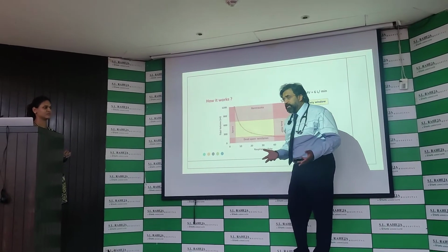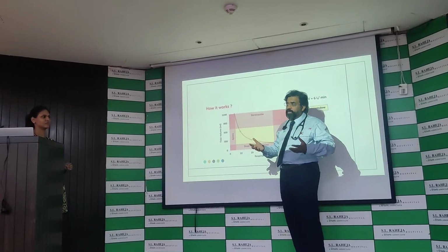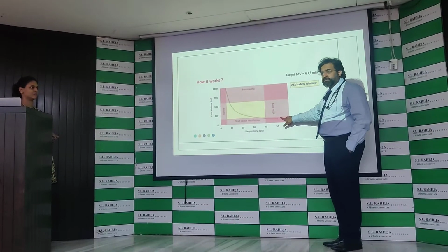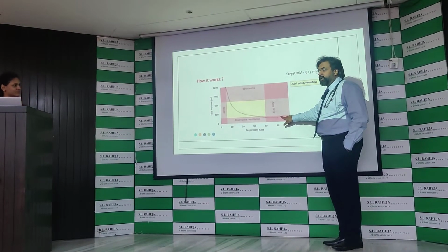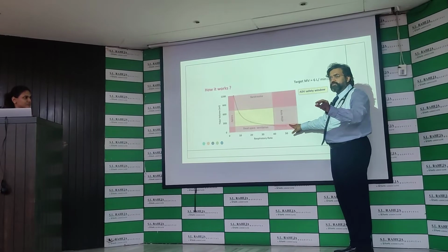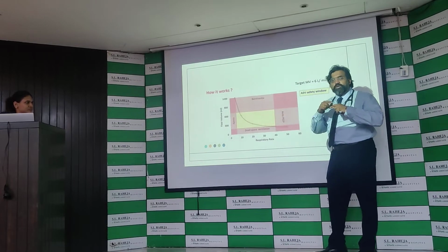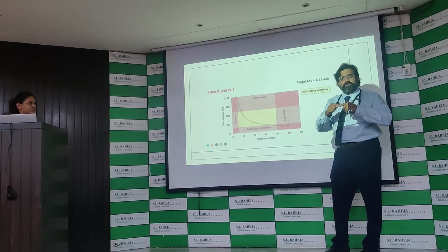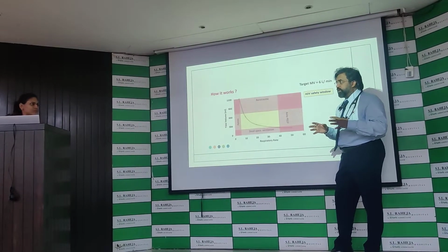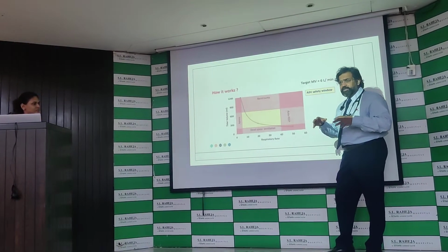Otherwise, what I would do if this patient is breathing fast, because he is having compliance issues. If he is breathing fast, he is somewhere around here, the outer box. So what will this ventilator do? It will try to slowly increase the pressures and the volumes, so he gets a little bit more volume. So his RR will come down, and this plus sign will come into this. It does this on a breath-to-breath basis. So the plus comes inside. Not a single breath is out of this. That's the point. One breath may come, so again everything has to become normal again. That is the intelligent part of the ventilation.